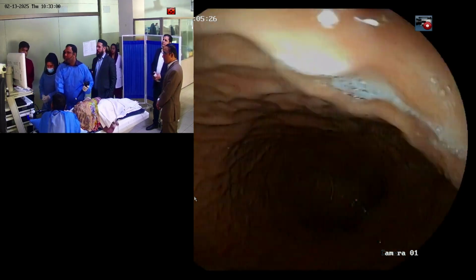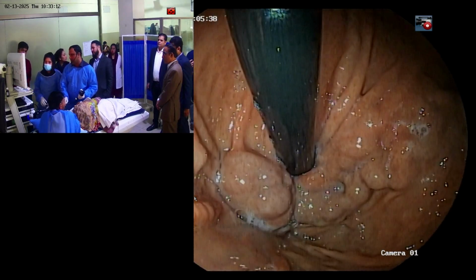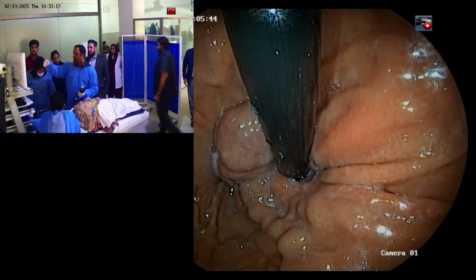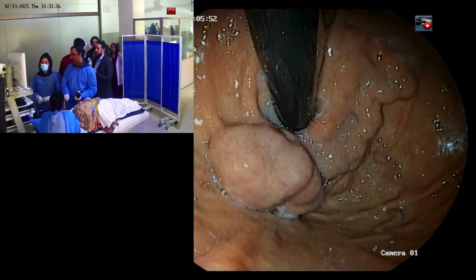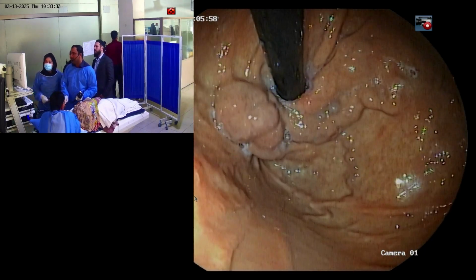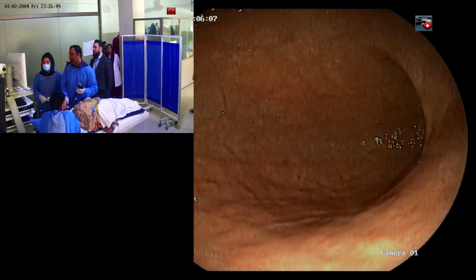And if you go into the stomach, you need to classify the varices as per Sarin classification, where it may be gastroesophageal varices 1 if the esophageal varices extend along with gastric varices along the lesser curve, or GOV2 like in this case, where there is fundal varix along the greater curve. And it may be isolated gastric varix, where there are no varices in the esophagus and only gastric varices along the fundus, or IGV2, where the varices are present elsewhere in the stomach, maybe in the mid body or in the antrum.